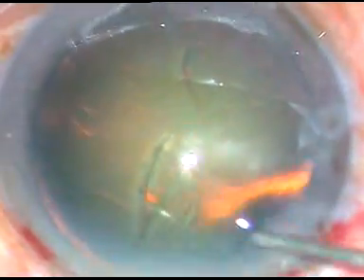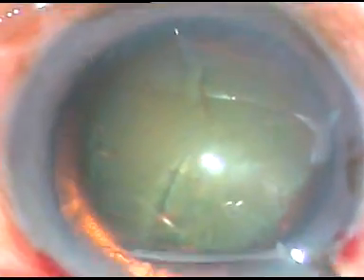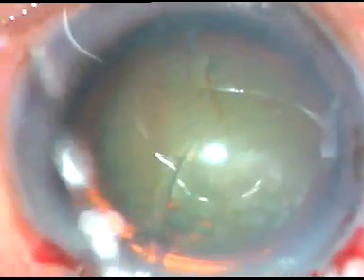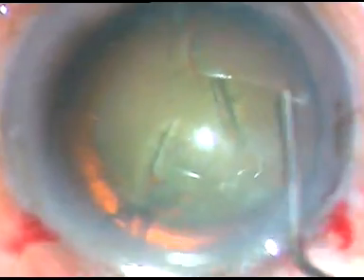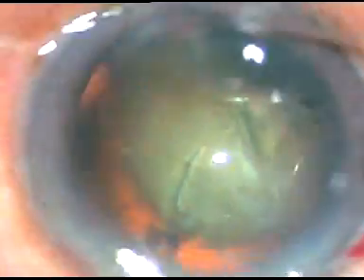Dear colleagues, this patient had a PC rent today. Let us see how it occurred and how it was managed. By this time all the incisions have been made. Hydrodissection is being done. The capsulorhexis is quite large.